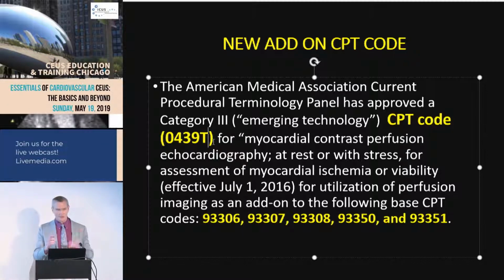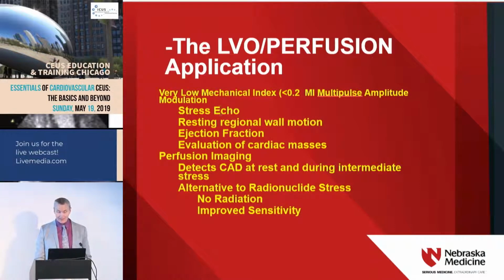So check that out. All you have to look for is the little circle that Steve told us to look at: what's transmit, what's receive. They should be the same. Philips got the message. Hopefully GE in the room, Siemens in the room, Toshiba, are they all here? Hopefully you get the message. Help us, because we've got a technique here that's going to be very helpful. It should be, within 5 to 10 years, the standard for stress imaging.